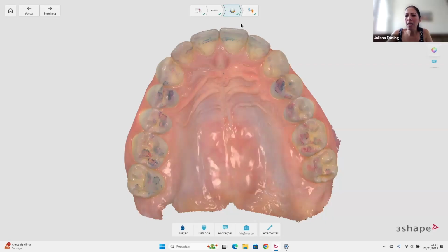And why? Because it's like a physical law. If I have a large surface contact, I need more force to make movements, to slide between teeth. If I have punctual contacts, it's like a box. If I have a heavy box on the floor, I need X force to move this box.